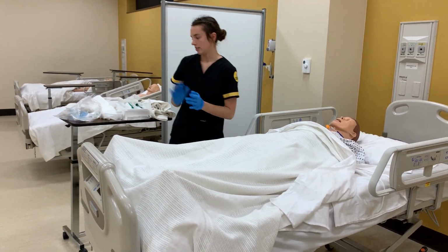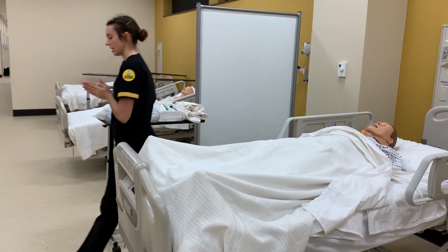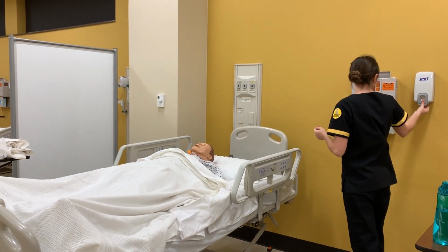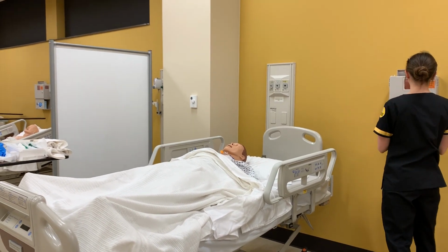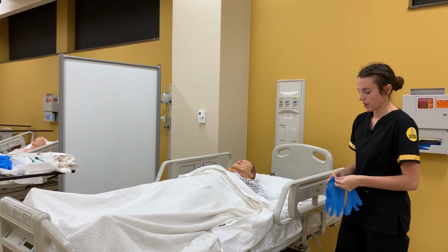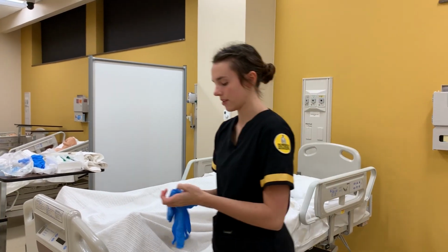So I would leave, take off my gloves, and then it's time to remove the catheter. So, hey, Mr. Benjamin, we're going to remove your catheter today. Your hip's doing better, so they're going to let you start ambulating, walking around, so we might can get you to the actual toilet so you can void as normal.